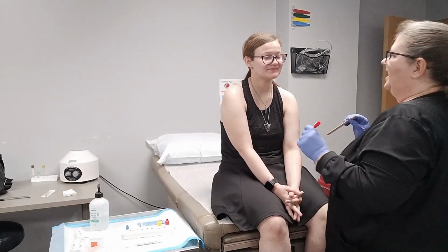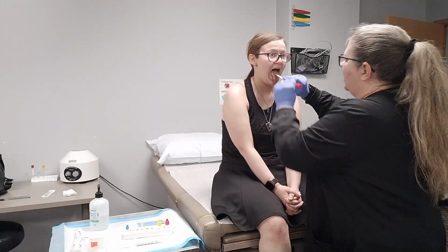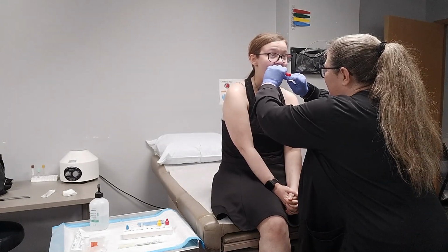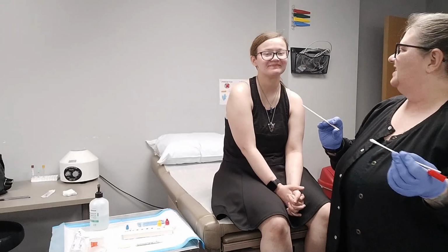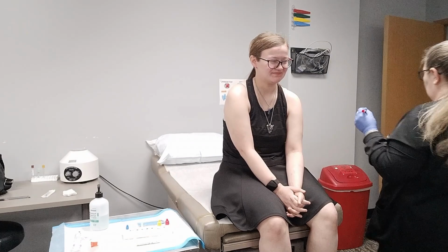I am ready. Okay, so here we go. Go ahead and open your mouth, stick your tongue out, and say ah for me. All right, perfect. And she didn't gag. Excellent. This will go ahead and go into biohazard.